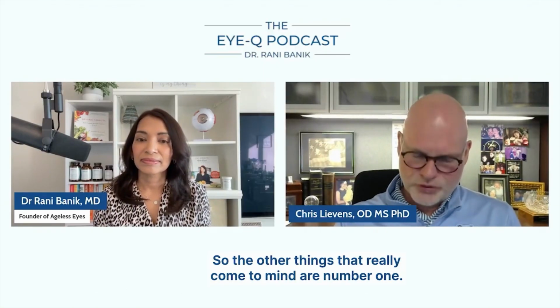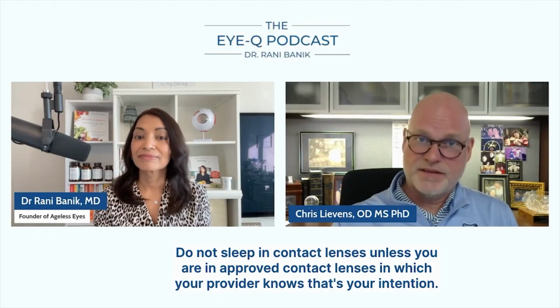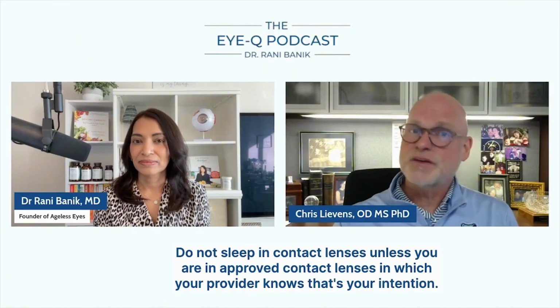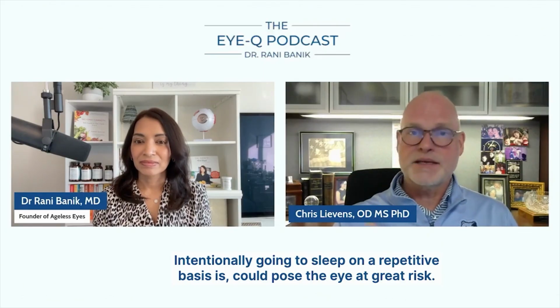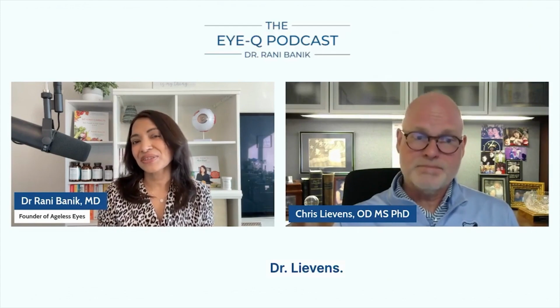The other things that really come to mind are, number one, do not sleep in contact lenses unless you are in approved contact lenses in which your provider knows that's your intention. And I don't mean accidentally taking a nap for a minute. Intentionally going to sleep on a repetitive basis could pose the eye at great risk. Showering. Go for it, Dr. Lievens.